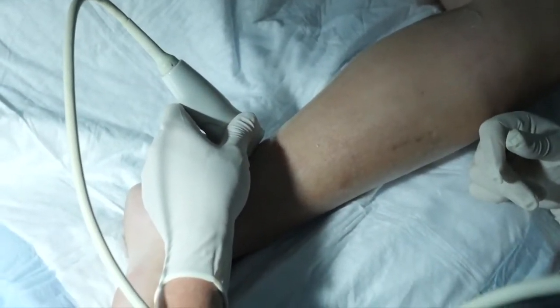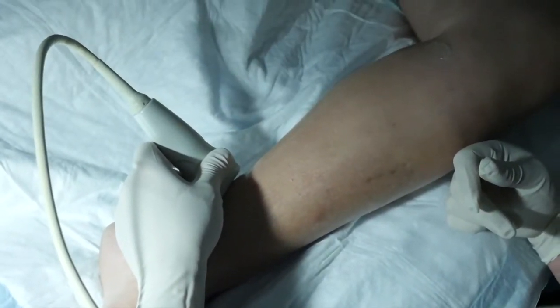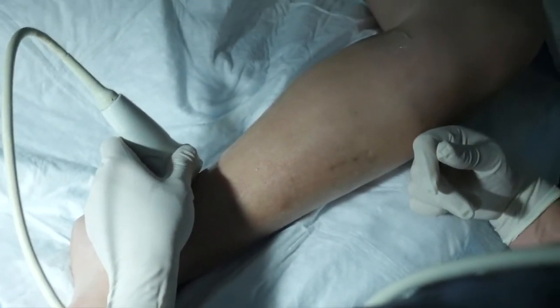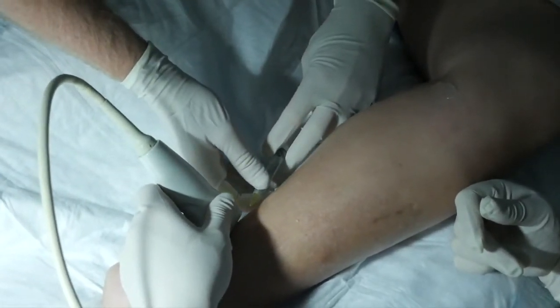Now we're repositioning our ultrasound probe over the perforating vein, and again we're going to try to get the superficial part of the perforating vein pointing to the left side of our ultrasound screen. And we're going to access this perforator through a longitudinal view.